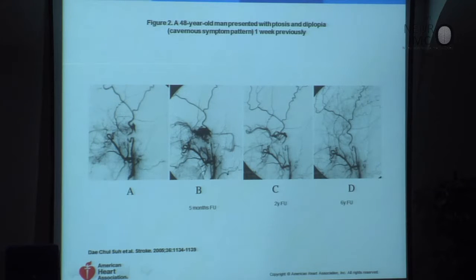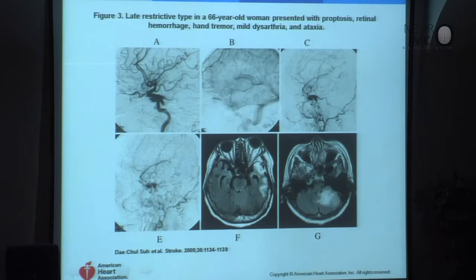This is stage 1A of disease progression, in contrast to the end stage of the disease. This is the other part of the end stage: the ICA-gram shows a dilated cavernous sinus and stasis of vein. The ECA-gram shows cortical venous regurgitation, which stays in the late venous phase. There is an edema, so-called venous infarction, in the temporal lobe and the cerebellar area. It's the other side of the terminal stage of cavernous sinus dural AVF.